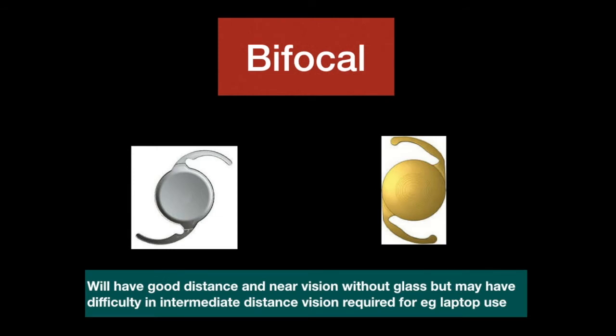Bifocal lenses have been in use for quite some time, and they give very good vision for distance and near, but intermediate distance is not good. So patients using a lot of laptops or mobile may find it a little difficult.